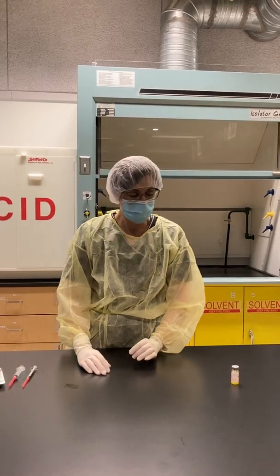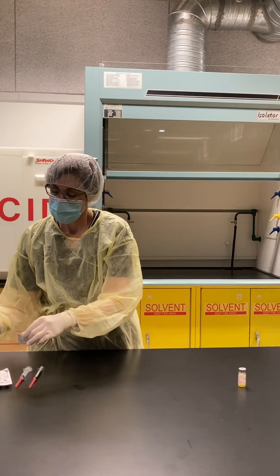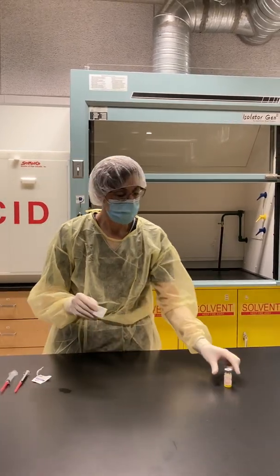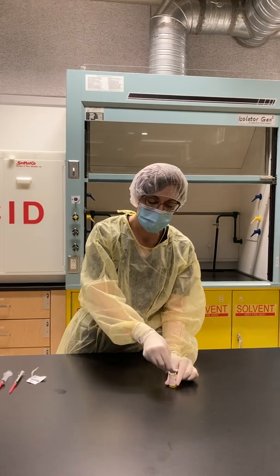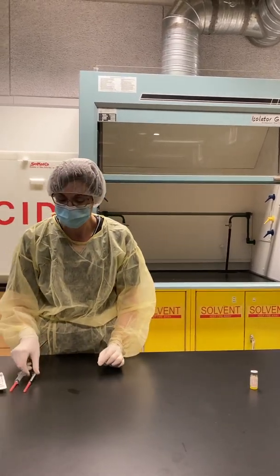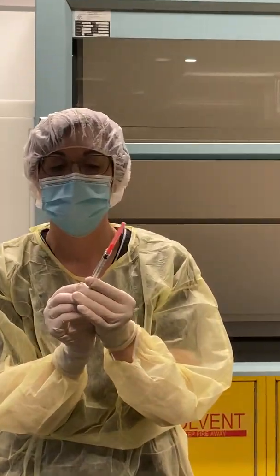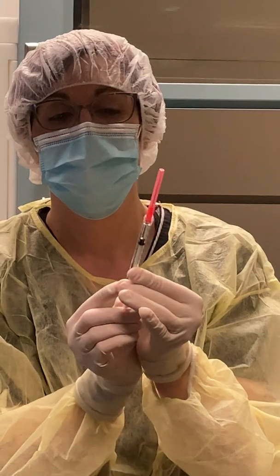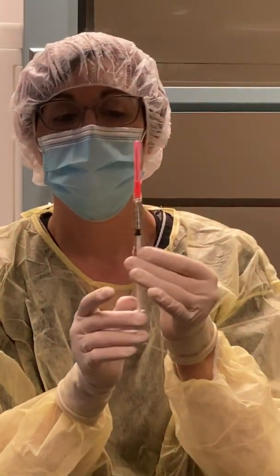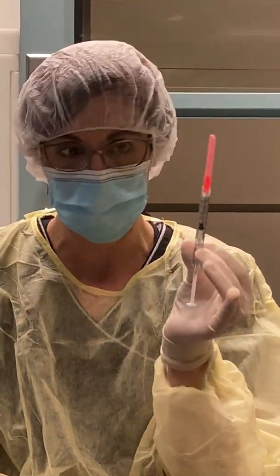For this patient, they are going to receive 0.5 ml of drug. So we are going to swab our vial and let the alcohol dry. I'm going to draw 0.5 ml of air because we've determined they're going to get 0.5 ml of drug.